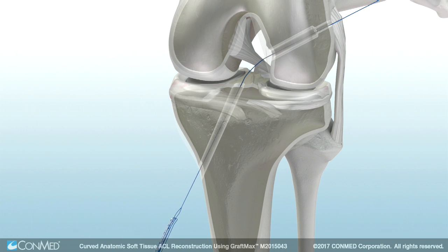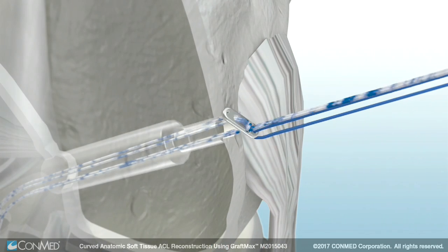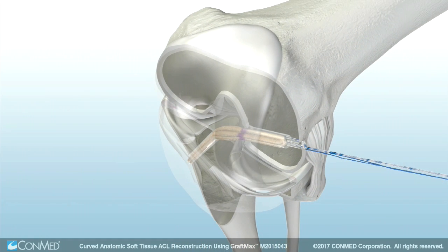Load the blue and striped suture tails of the GraftMax button into the passing suture. Pull up through the knee so that all four suture tails exit the skin. Advance the button through the bone tunnels by pulling on the blue lead suture while carefully removing any slack in the striped adjusting sutures along the way. Pull the soft tissue graft into the joint by pulling the striped sutures, reducing the loop length until the tissue is in the desired position. Cycle the knee with tension on the graft.